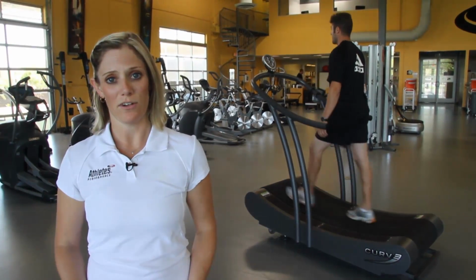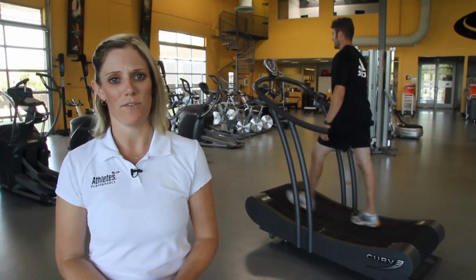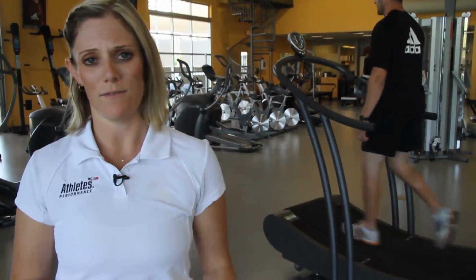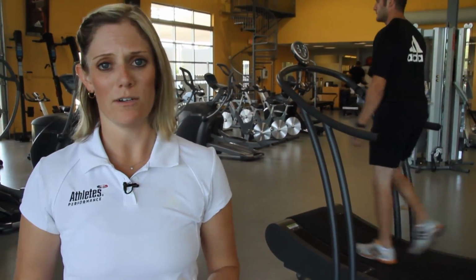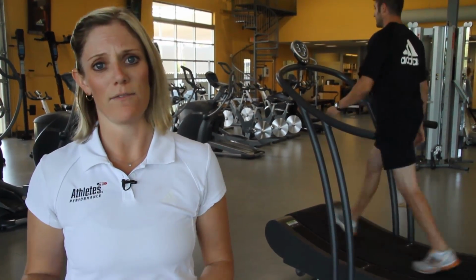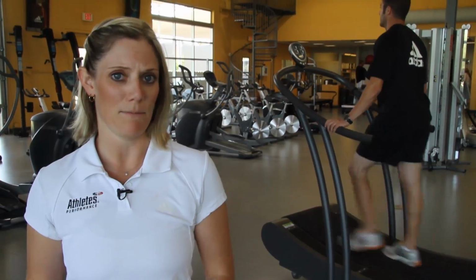This is very useful to use the Curve, not just for running or return to running or cardiovascular conditioning, but it has also been a really good tool for patients coming post-op with normalizing their gait asymmetries and helping them return to a more normal gait function for basic activities of daily living, or ADLs. One thing we can do with the Curve is that it's very good at amplifying people's gait asymmetries or gait dysfunctions from left to right side, especially if they've come off of weight-bearing limitations, if they've been partial and non-weight-bearing on one side. It takes time for the body to normalize that gait pattern.